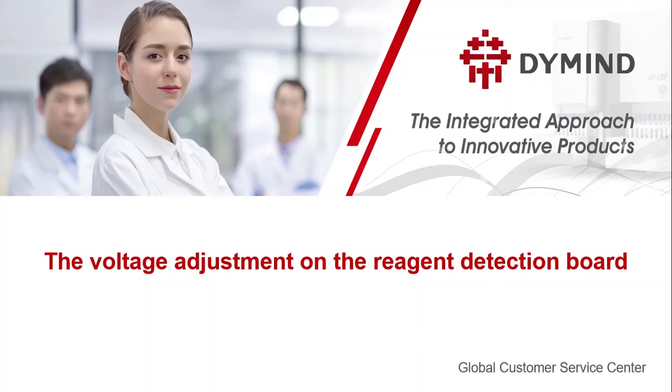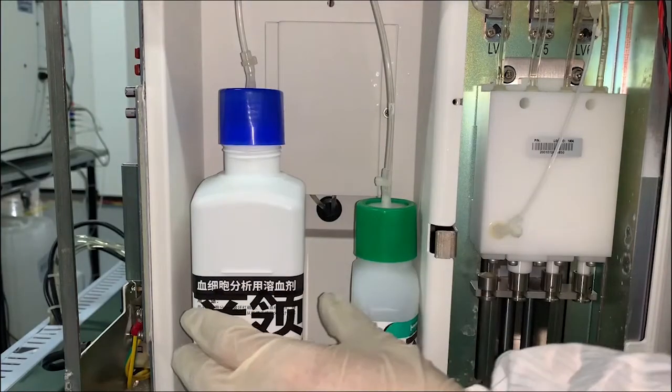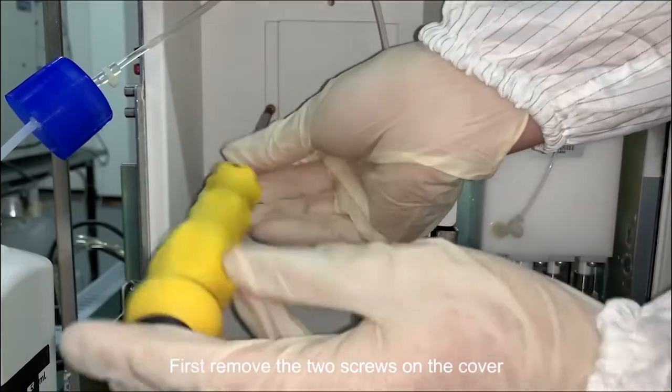Here we introduce how to adjust the voltage on the reagent detection board. First, remove the two screws on the cover.